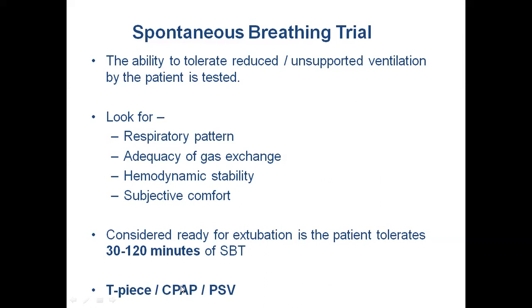And in CPAP, it can get PEEP. In PSV, you can get PEEP as well as pressure support. So you need to choose for which patient. In newborns, you cannot use T-piece because the endotracheal tube is so small that even that can cause more resistance to the children. So at least you need to give a little bit of PSV. At least minimal PSV you need to provide for a newborn. You cannot use a spontaneous breathing trial by T-piece for a newborn.